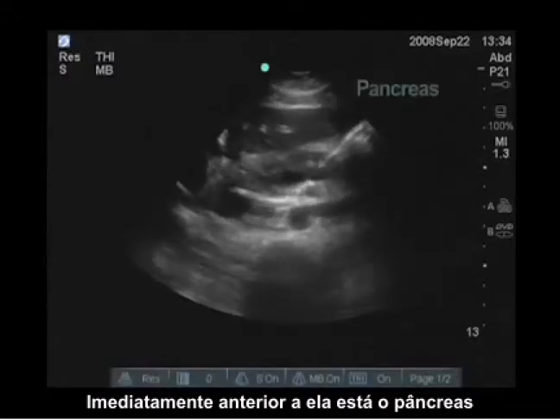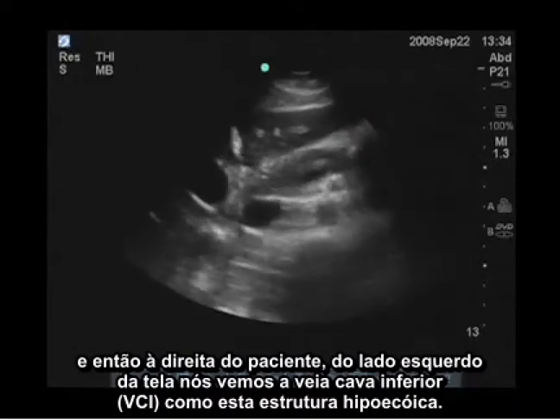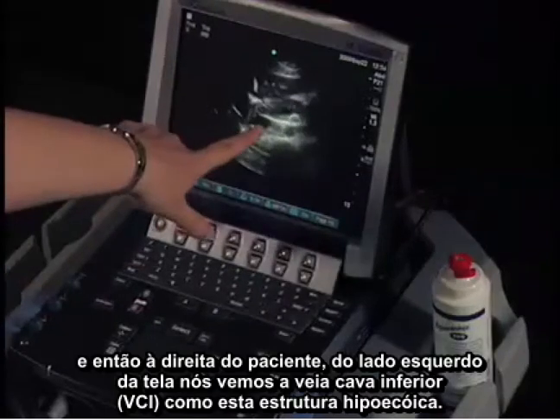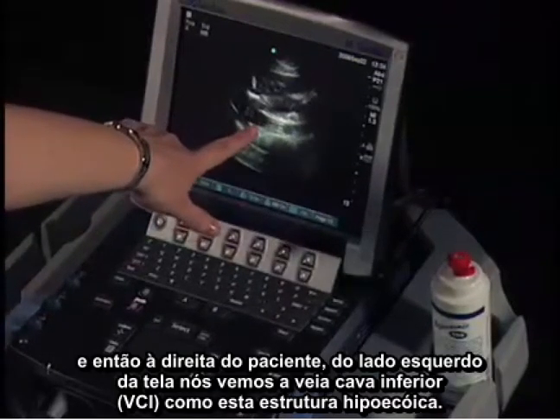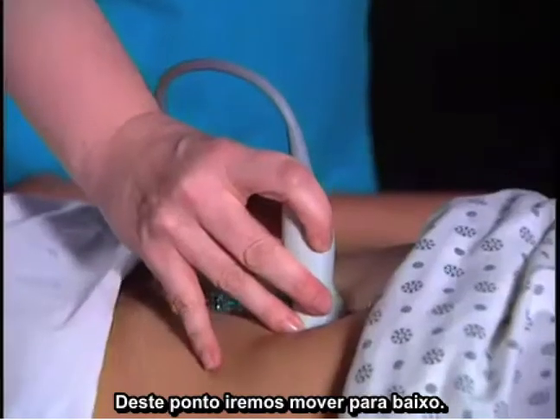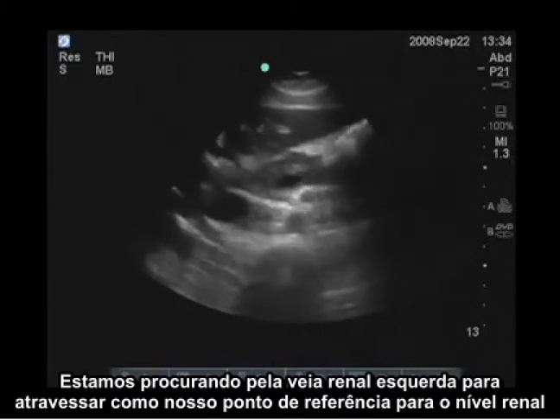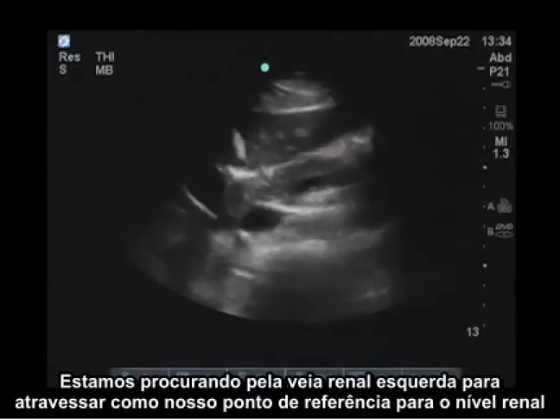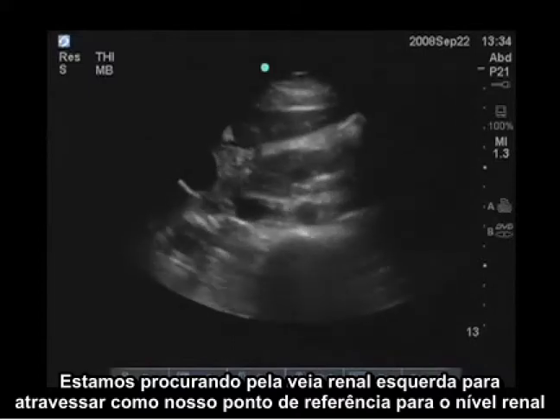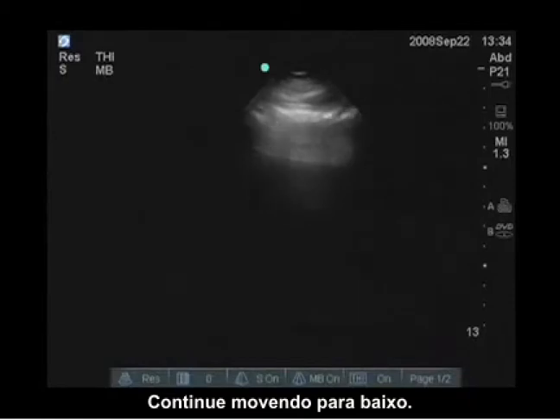Immediately anterior to this is the pancreas, and then to the right of the patient, on the left of the screen, we see the IVC as this hypoechoic structure. So from this point we're going to move down. We're looking for the left renal vein to cross over as our landmark for the renal level. And we're going to continue moving inferiorly.